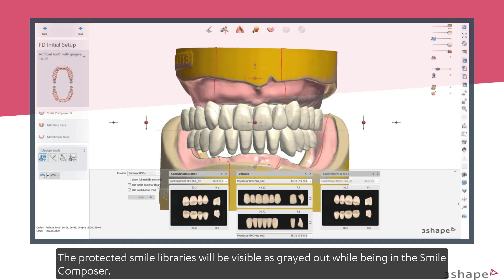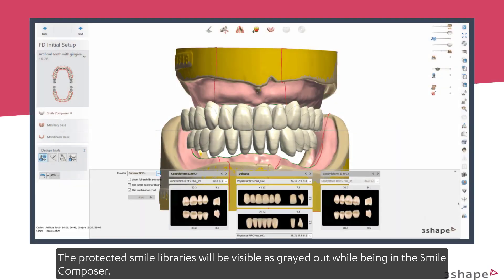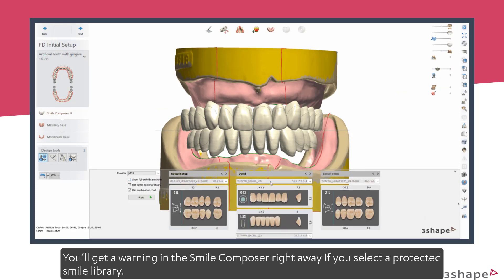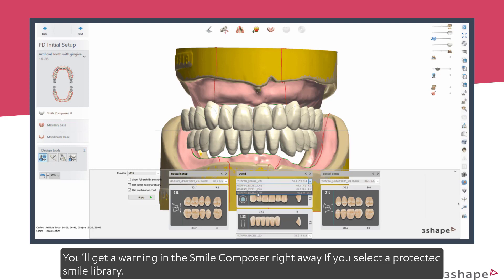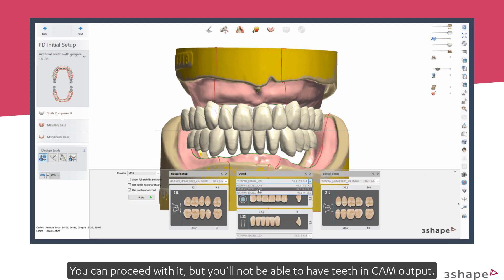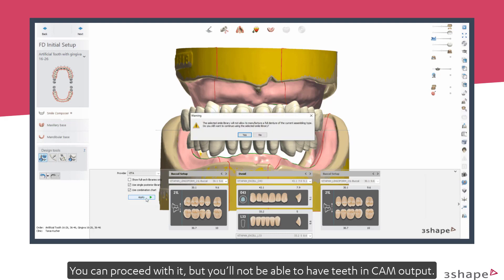The protected smile libraries will be visible as greyed out while being in the Smile Composer. You'll get a warning in the Smile Composer right away if you select a protected smile library. You can proceed with it, but you'll not be able to have teeth in CAM output.